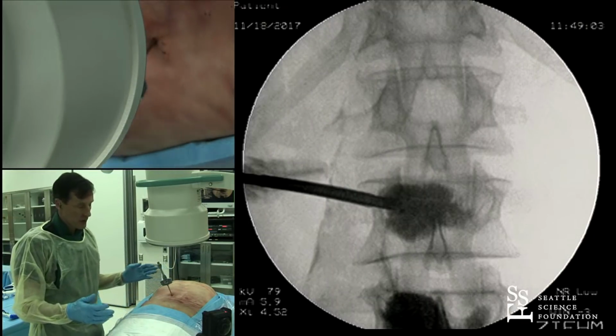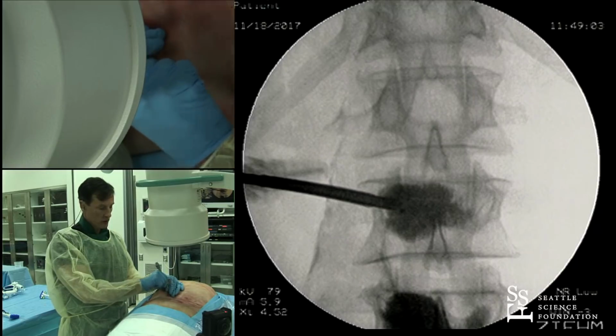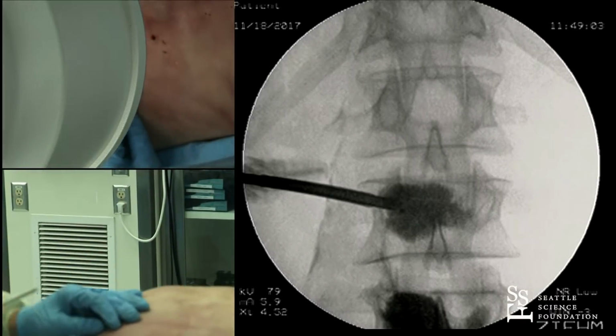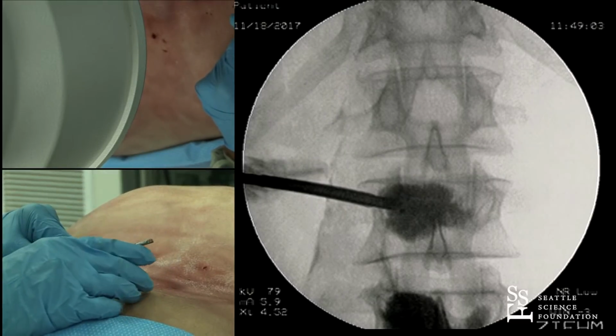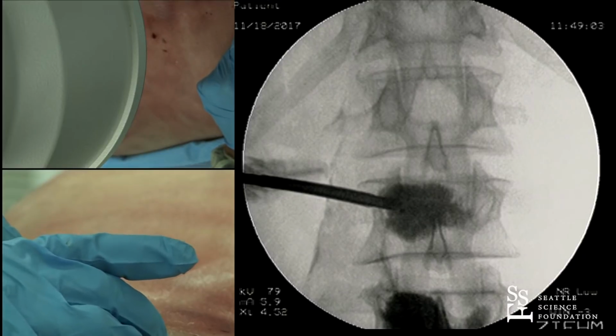After you're finished, and after the cement hardens, you take the needle, turn it in this direction, then turn it the other direction, and you can pull it directly out. What it does is it shears the implant. It's designed to break. When it goes in and pulls back, it has great resistance to force, but when it twists, it can break, and it's designed to do that.